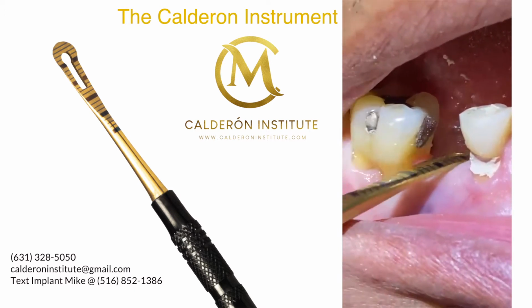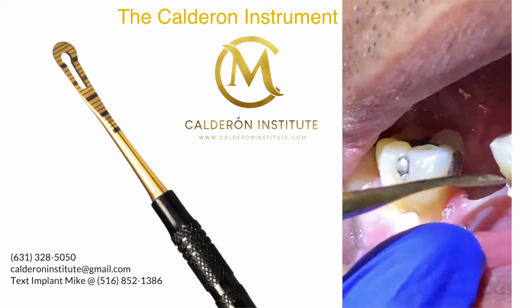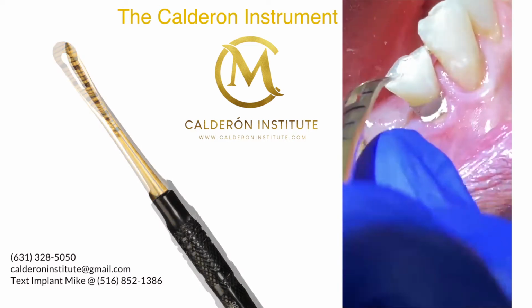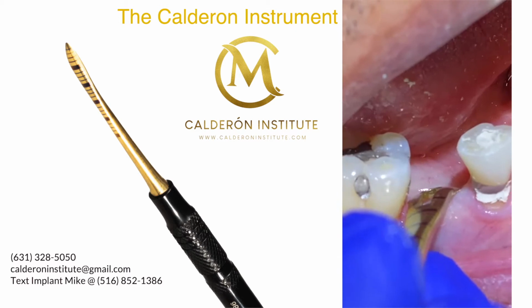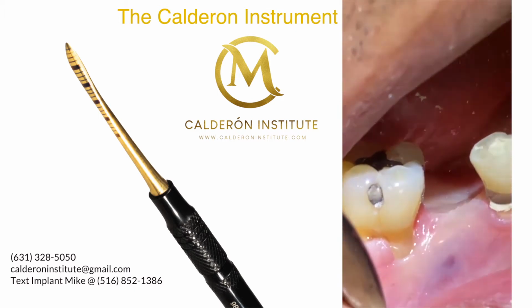Now, how wide is this ridge? Okay, so G is going to come over here because G gets great at filming everything. Okay, and we're going to look over here. G, can you see on top of here? It doesn't matter if you block my way. So, how wide is this ridge? This ridge is coming from this side to this side. So I can grab a probe. Just a moment. You can keep on filming, G.